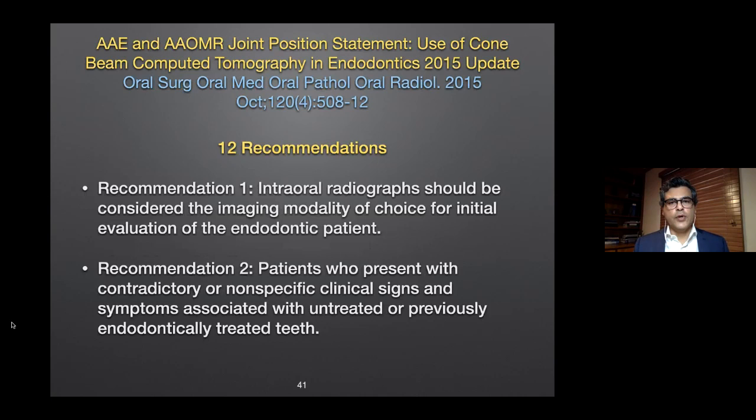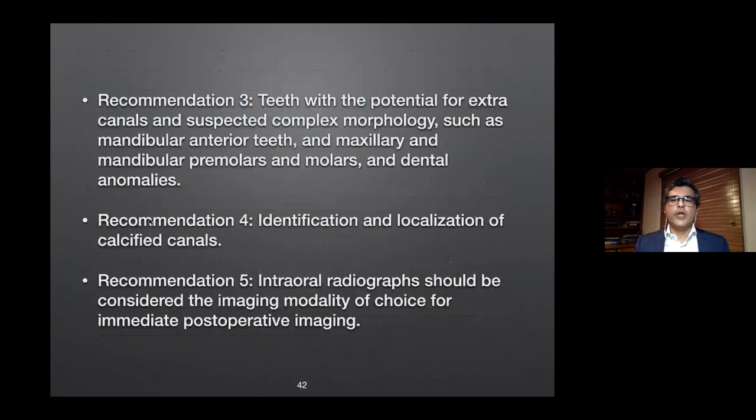They say intraoral radiographs should be considered the imaging modality of choice for initial evaluation of the endodontic patient. That's pretty standard, and should be kept in mind. Patients who present with contradictory or non-specific clinical signs and symptoms associated with untreated or previously endodontically treated teeth, so essentially retreatment patients, are where there will be an indication for cone beam CT. Also teeth with potential for extra canals, for example the mesiobuccal canal in maxillary first molars.